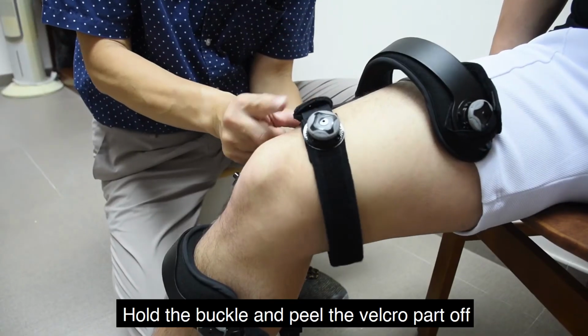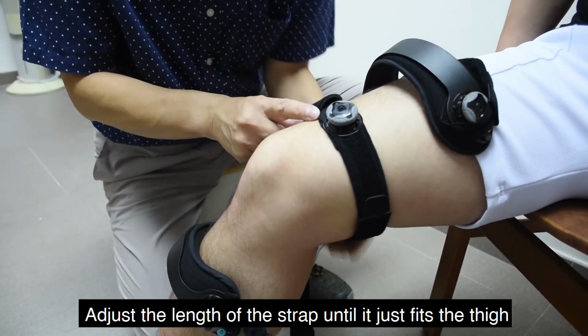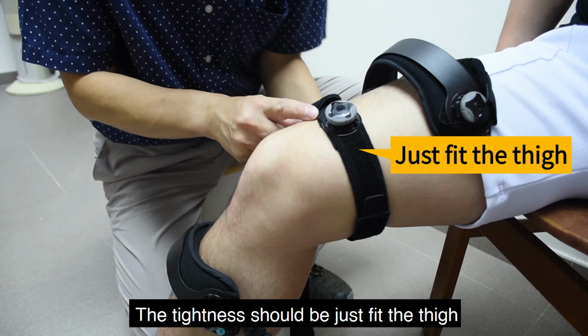Hold the buckle and peel the Velcro part off. Adjust the length of the strap until it just fits the thigh. Do not set strap 1 too loose or too tight. The tightness should be just fit the thigh.